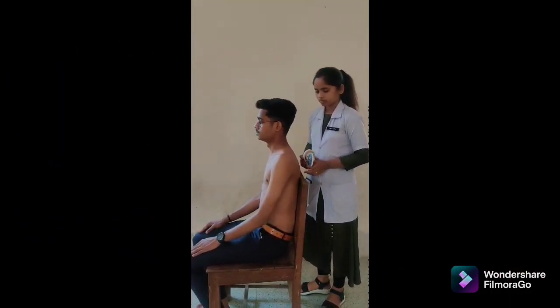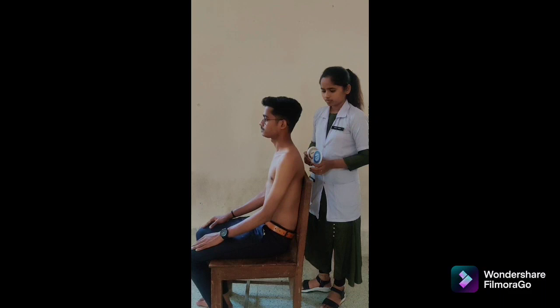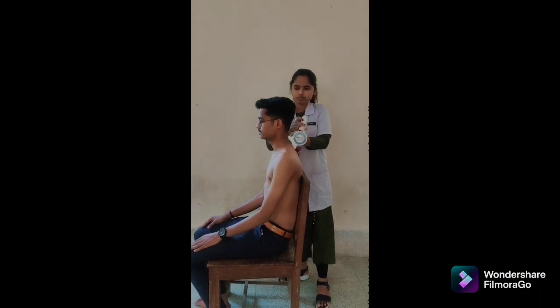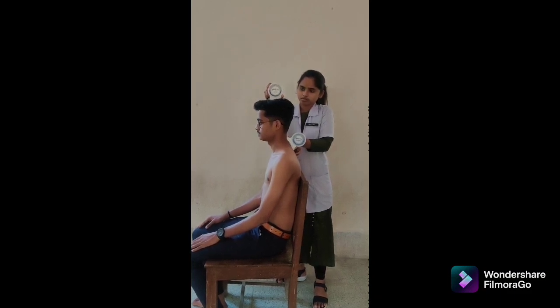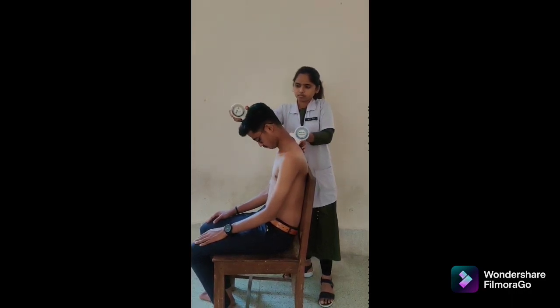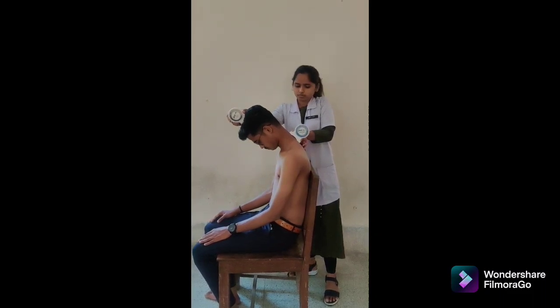We are going to perform cervical flexion with double inclinometer. Patient position: sitting with thoracic and lumbar spine well supported by back of chair. Inclinometer alignment: place one inclinometer over the spinous process of T1 vertebra, and the second on top of the head. Both inclinometers are adjusted to 0 degrees. The examiner should maintain both inclinometers throughout the motion. Instruction: bend the head forward while keeping the trunk straight. At the end of motion, read degrees from both inclinometers. The range of motion is the difference between the two readings. Normal range: 0 to 50 degrees.